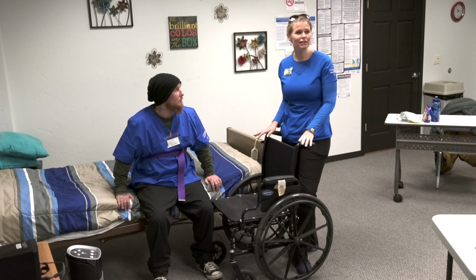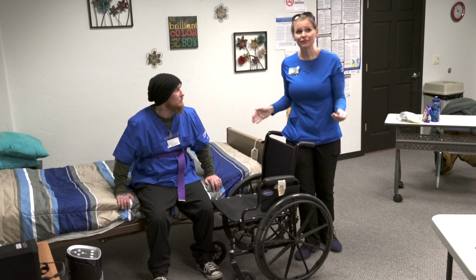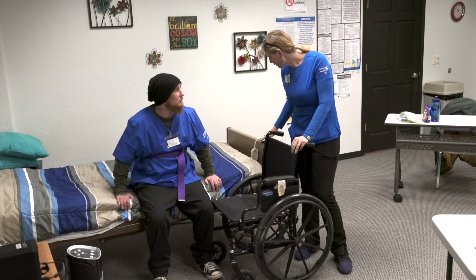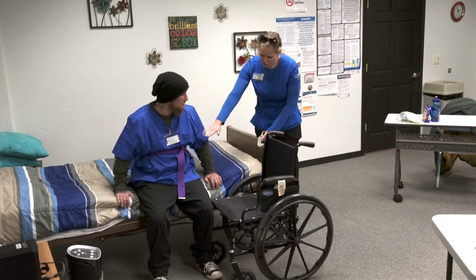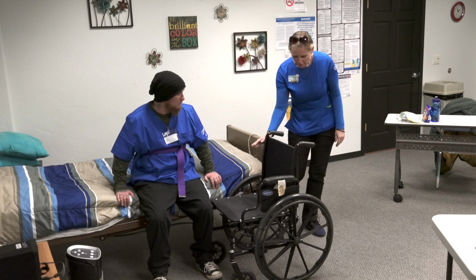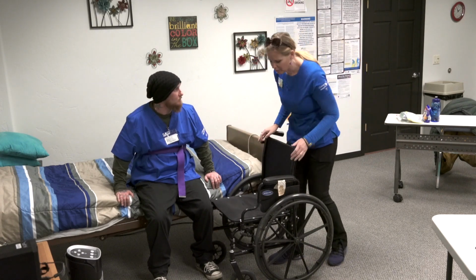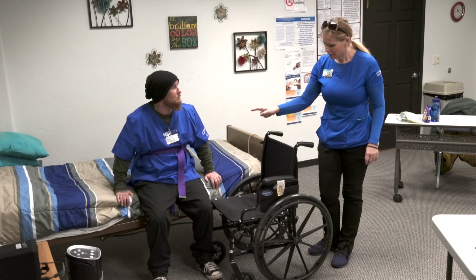How many pounds are we technically allowed to lift? 25. 25 pounds. So we are not lifting them, we are scooching them. So we want to use gravity. Gravity is our friend. So I'm going to put the bed up just a little bit because what I'm going to do is scooch Cody from the bed into the wheelchair. I want this up so that I don't have to go up and over. I'm going to make sure that these are locked into place. My gait belt's on and in place.